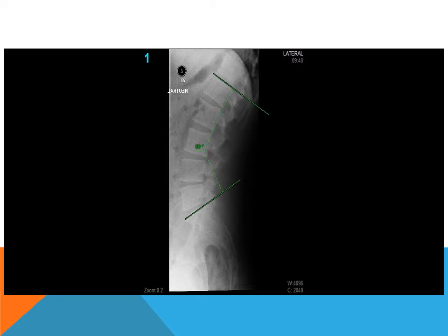We're now going to put the injured worker through movements of flexion and extension, and that lumbar lordosis is going to change from its neutral position of 60 degrees. It's going to reduce as the spine goes into flexion. It's going to increase as we go into extension. And measuring the lumbar lordosis angle in the neutral position gives you a starting point.